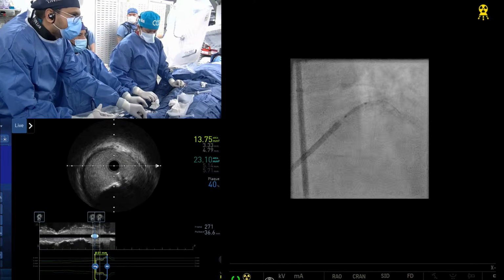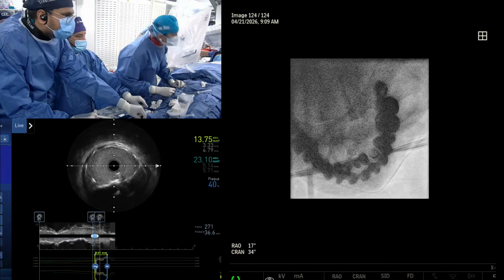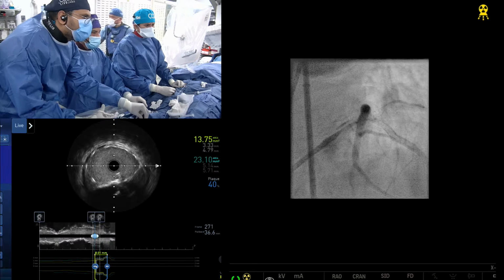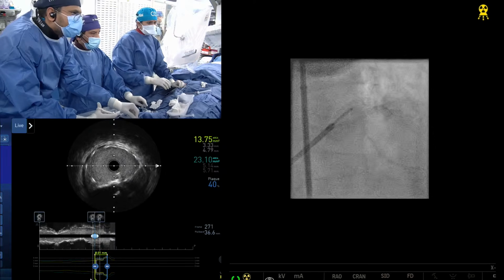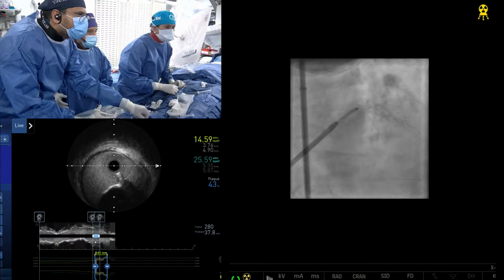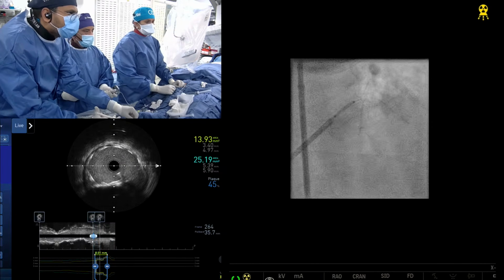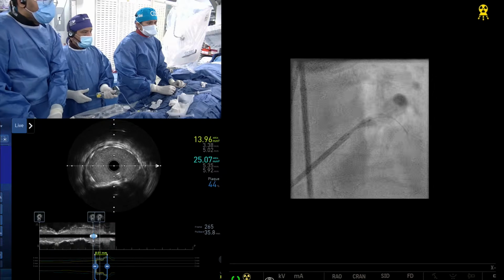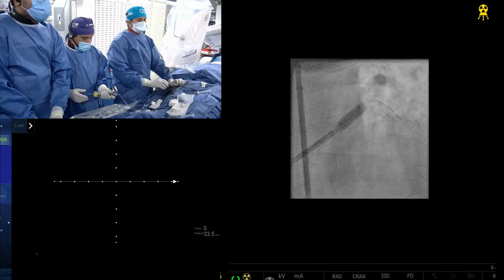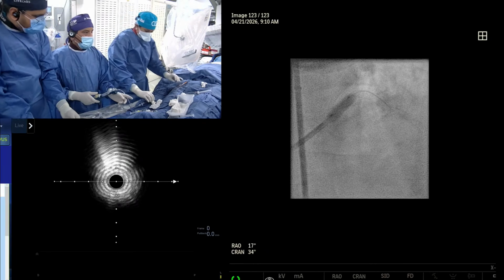Some dye. No, don't move. Head down. Okay, now dye. Too much now sticking out distal. Okay, good. Wait, let me just take a cine and document it. Oh, good. Going up. Get the IVUS again. But I didn't see it the first time. There's no dissection. This 12 stent is okay.